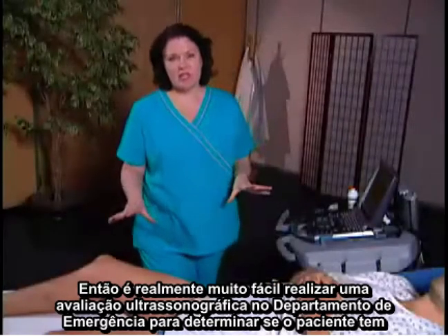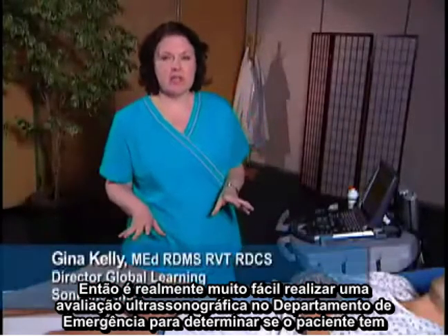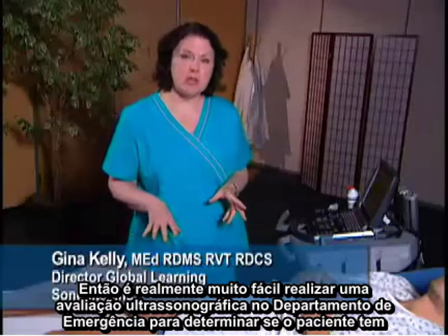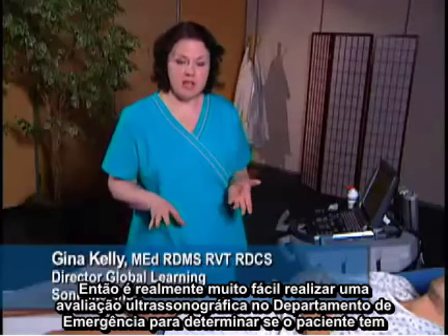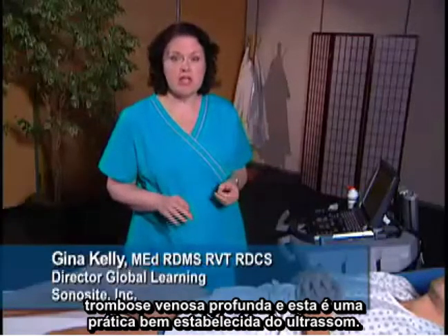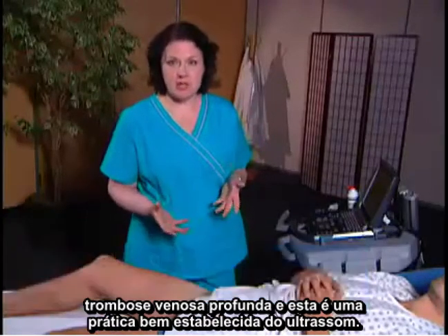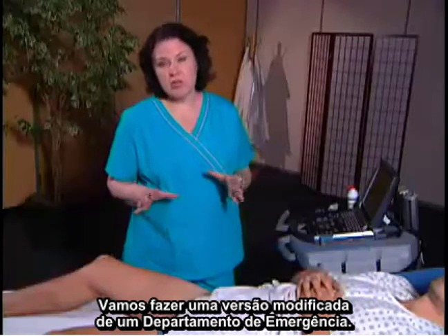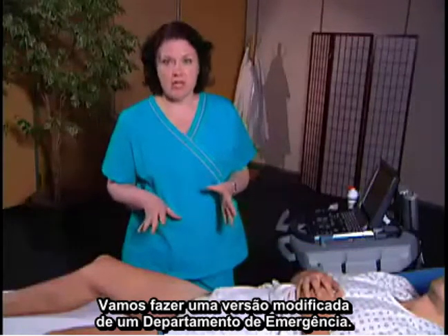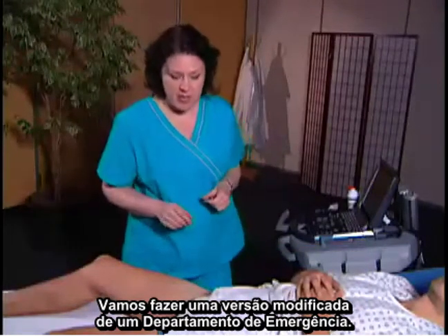It's actually quite easy to do an ultrasound examination in the ED to determine if a patient has deep vein thrombosis. This is a well-established practice of ultrasound. We're going to do a modified version of that for the ED exam.